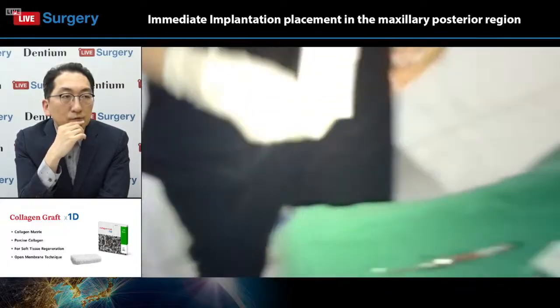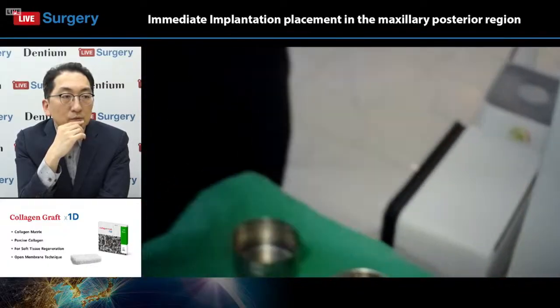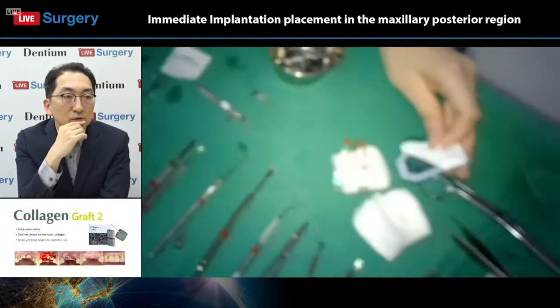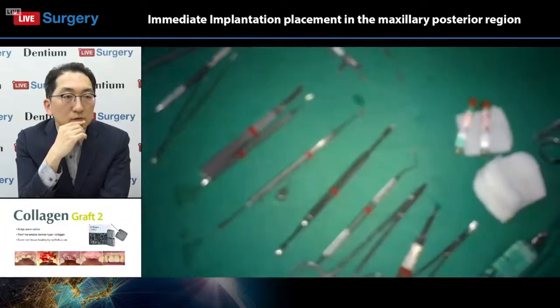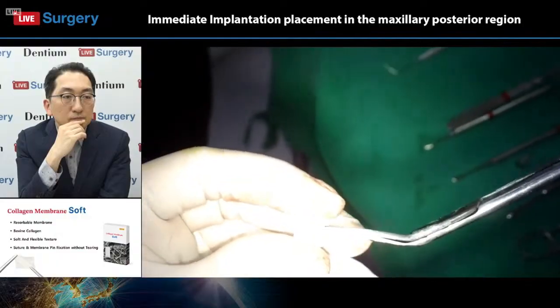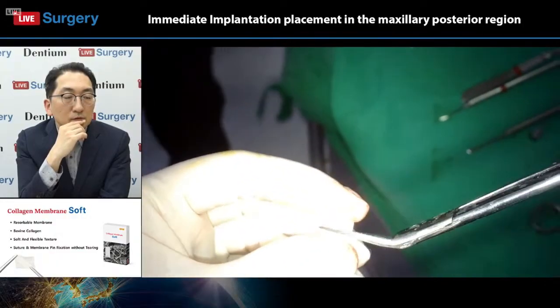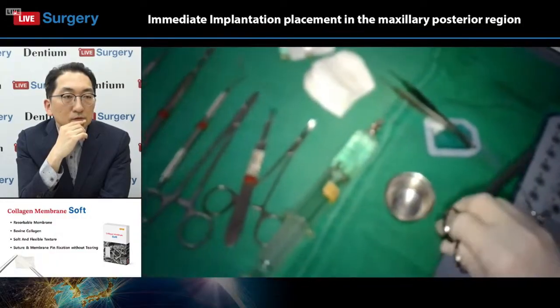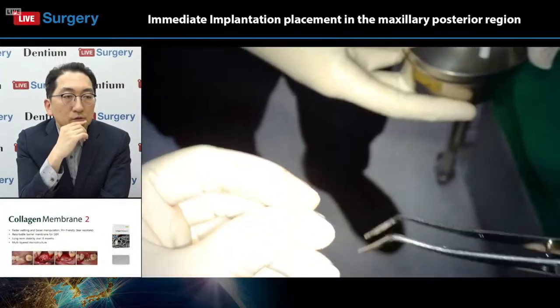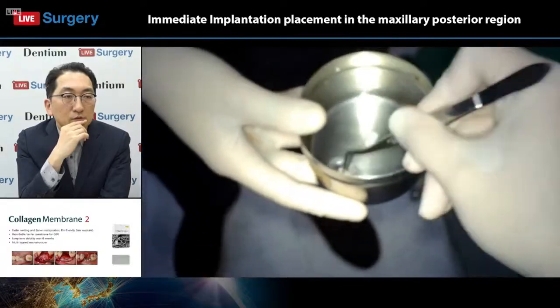The 24 side is also an immediate implant placement in the extraction socket. So as at the 27 site, I will use the collagen graft.